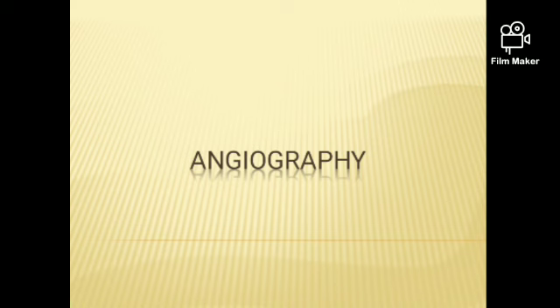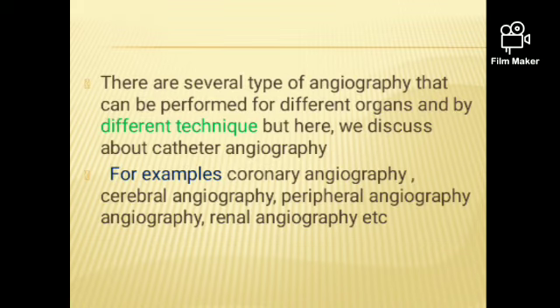So when we talk about angiography, what is angiography? Angiography is the technique which we perform mainly on the blood vessel studies. We can say that angio means blood vessel and graphy means the study. This technique can be direct or indirect. We can directly inject into the blood vessel or we can indirectly also inject into the blood vessel. And in this study, mainly we will see the arteries and the veins of our body.